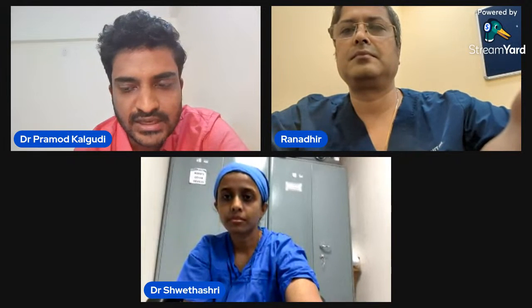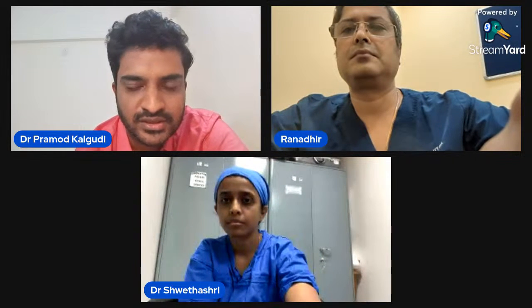Routinely, we use it on all the patients who require it, like stroke patients, aneurysmal patients, be it infarct or be it bleed. Sometimes we see the resolution of the bleed. Sometimes we see the vasospasms. Sometimes we diagnose the flow reversals in the brain dead. So we use it routinely in the ICU.